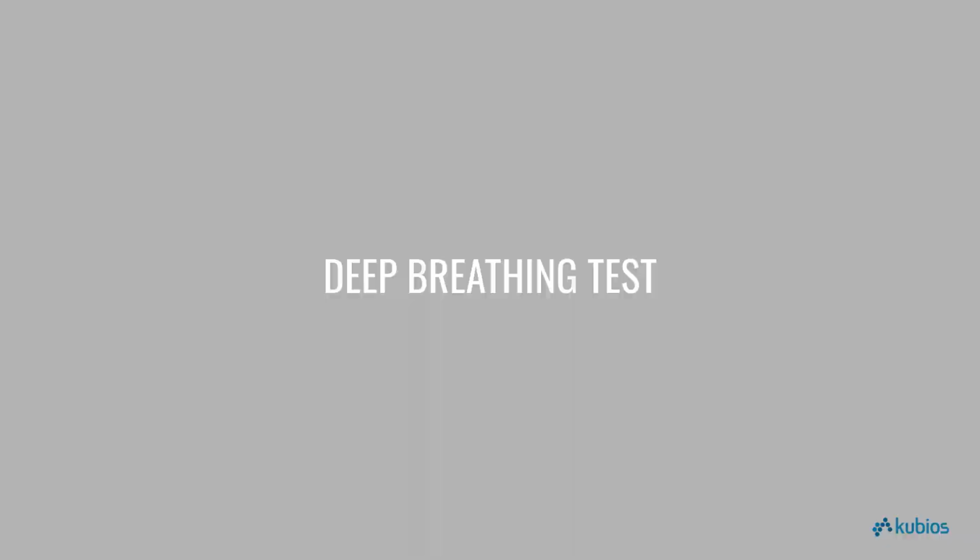Now, we'll move on to the second test, the deep breathing challenge. We'll explore how this maneuver elicits a characteristic heart rate response, providing further insights into ANS activity.